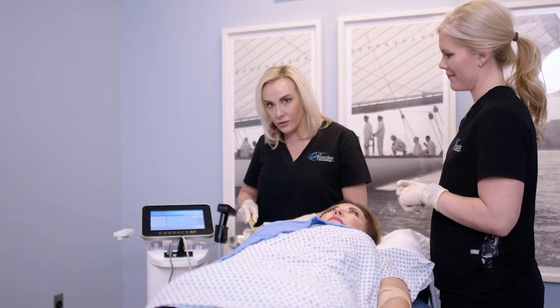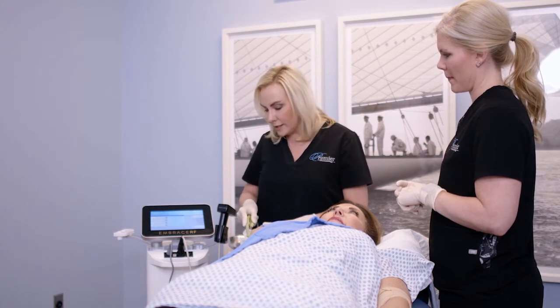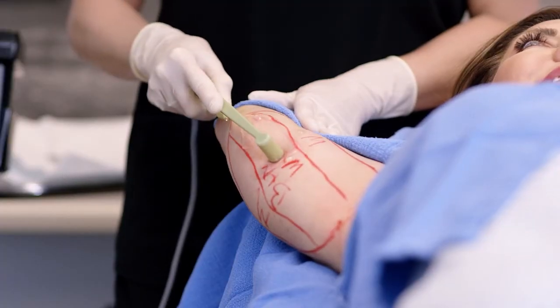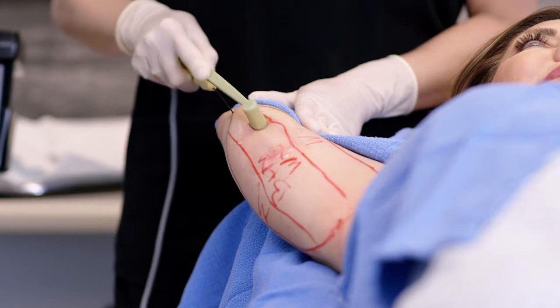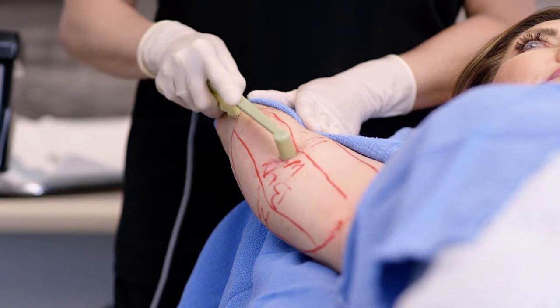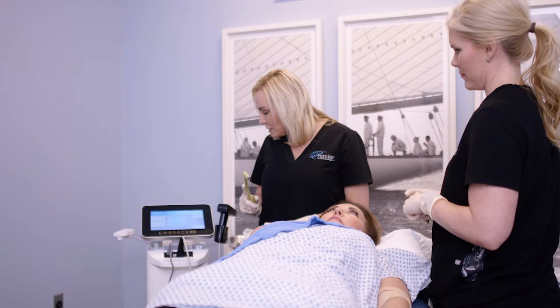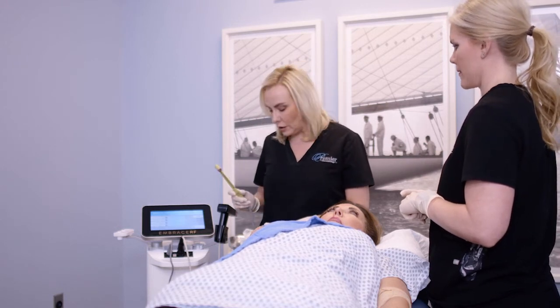We've reached our internal temperature of 70 already, and we're gradually getting that external temperature up, and there it is. That noise where it kind of hits that. That's the magic. So we know once we consistently hear that all the way across the area that the treatment in this area is complete. So that's going to be 1.2 kilojoules on the superior portion, Erin.